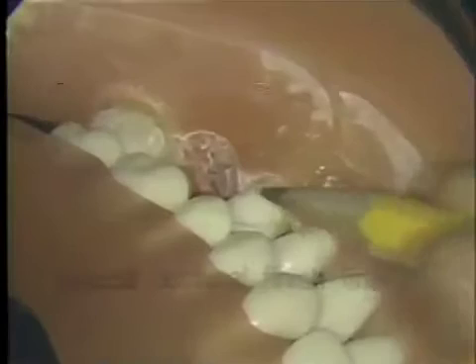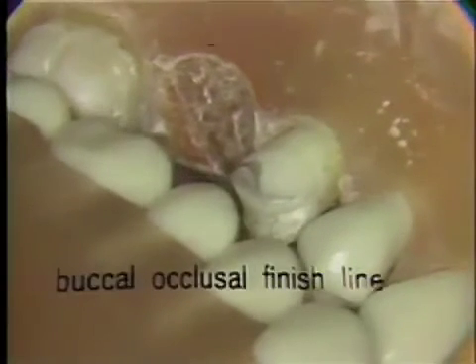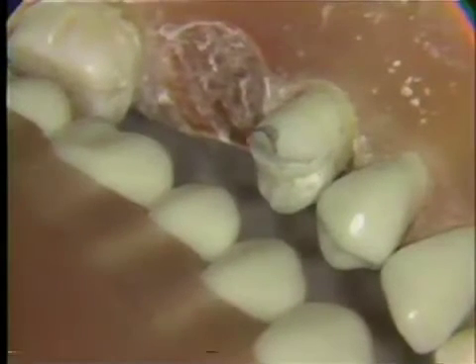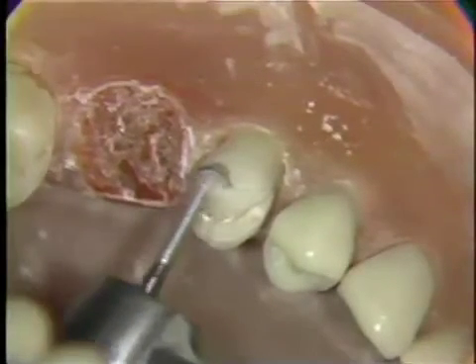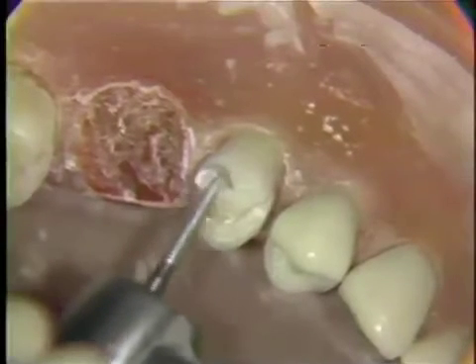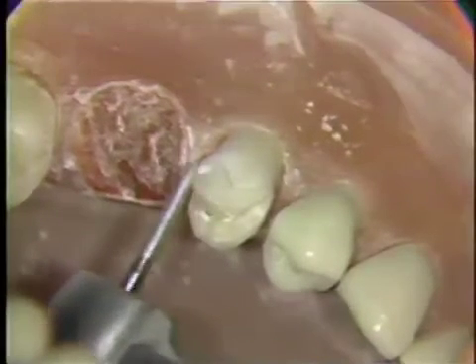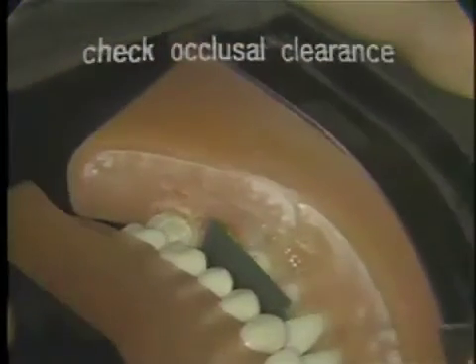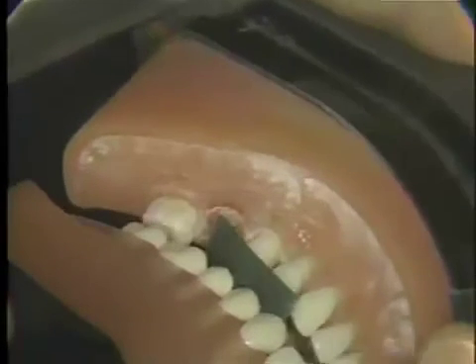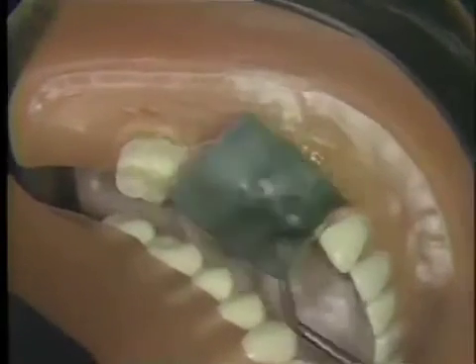The occlusion is then checked from the seven o'clock position, and a pencil line is placed showing the buccal occlusal extension of the finishing line. The same diamond is then used to reduce this occlusal surface, which will ultimately be protected against the forces of the opposing cusps. The occlusal reduction is checked with three thicknesses of 28-gauge green wax and observed for equal density. If there are modifications needed, they can be done at this time.